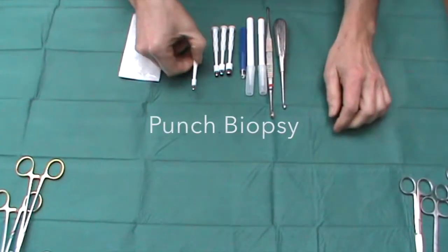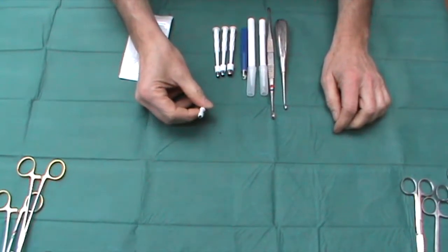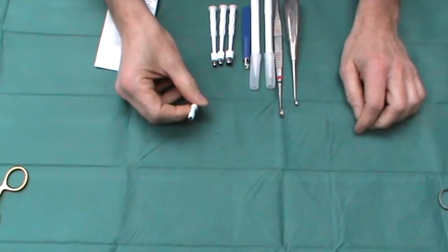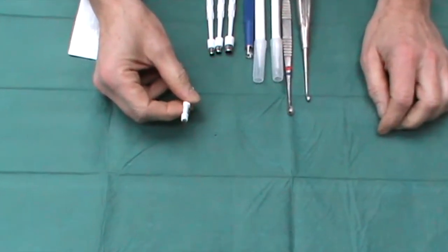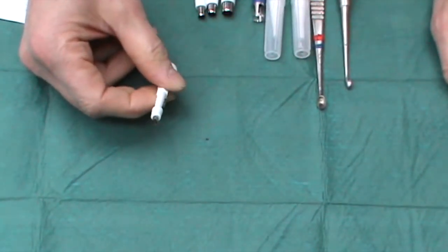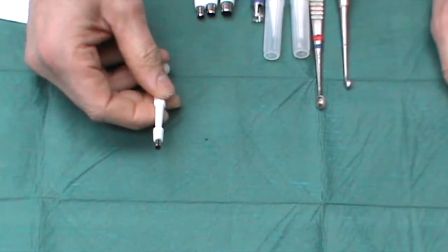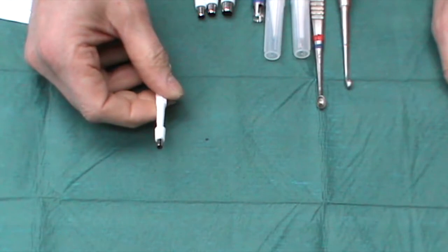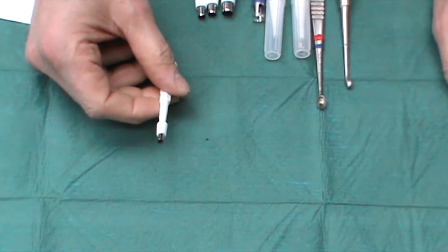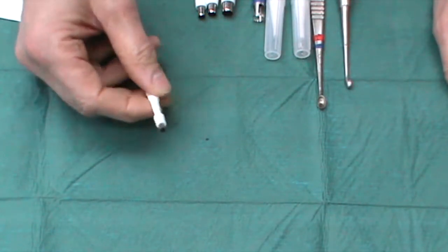One of the useful disposable items we use in minor surgery is the punch biopsy. This is a 4mm punch — the ideal workhorse — used for biopsying rashes or maybe superficial cancers for histology. They also come in 3mm and 2mm diameter. 2mm really is too small for histopathologists to analyse the specimen. 3mm is about the smallest you can use, and I tend to use that for facial punch biopsies.